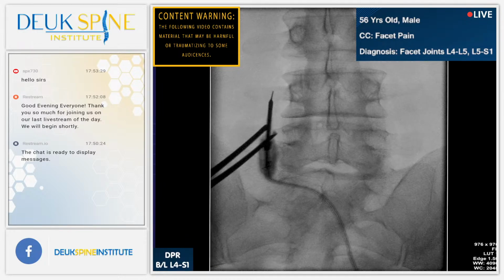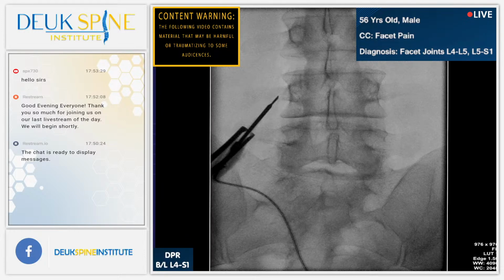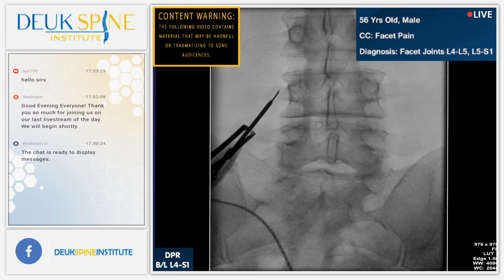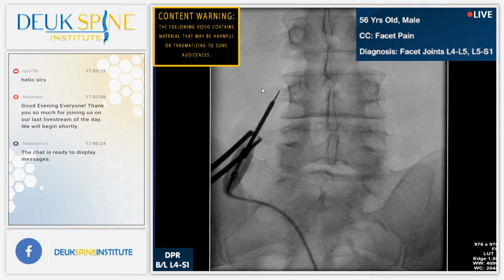Every time I say shot, what I'm actually doing is taking a picture with my x-ray machine. Shot. That feels like facet right there. Shot. That's it right there, Jordan? Yes, sir. Shot. And you can see the transverse process on the picture there. Shot. That's really nice right there.